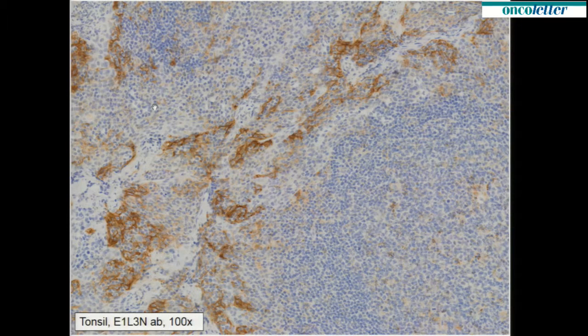Now, to do this, you need controls. The control today is the tonsil, which, as you can see, the crypt epithelia are always positive for PD-L1. And there is some minor positivity in these immune cells of the germinal center. So that's how it should look, and that's acceptable.